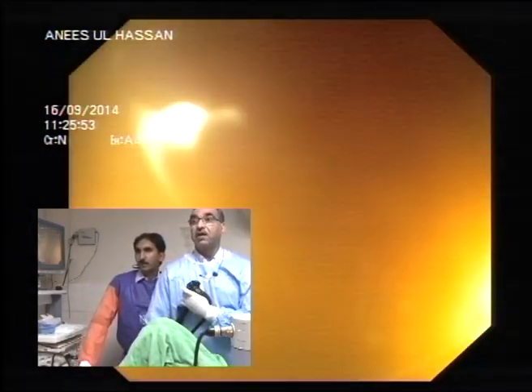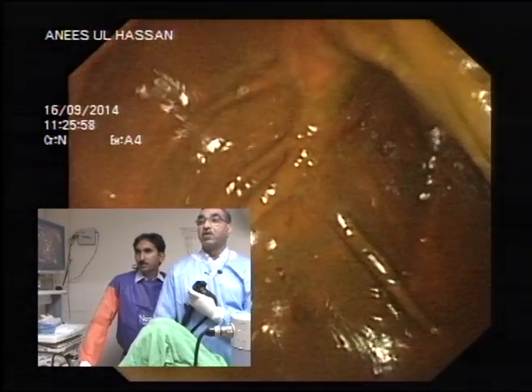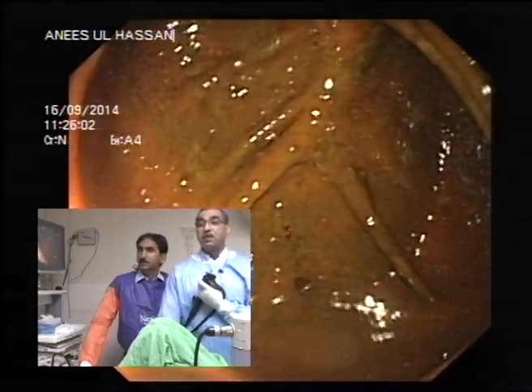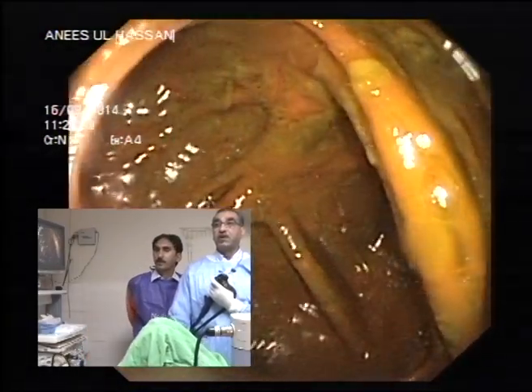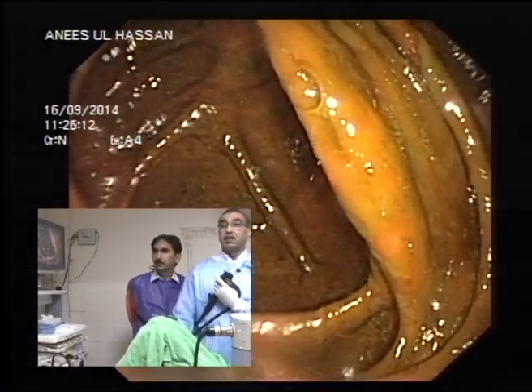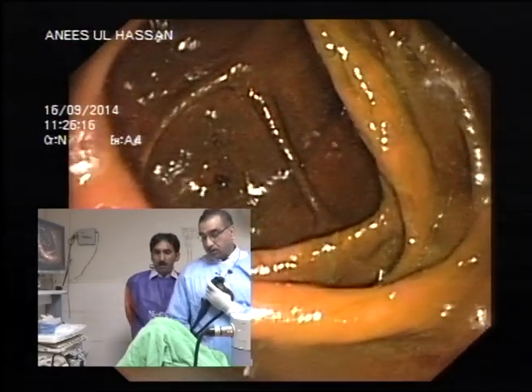So this is at the hepatic flexure. You went right from the ascending colon to the hepatic flexure. Now when I'm coming out like that, just watch, then you can do it yourself, right? You will see the fold coming in front of your field. So just see where it's coming from, right? Look there, not here, right? Okay, so we are coming out gently.